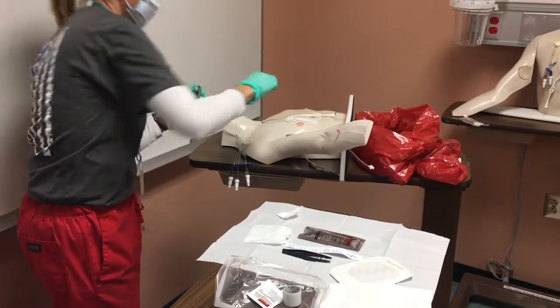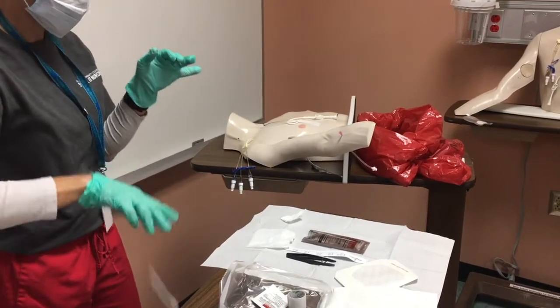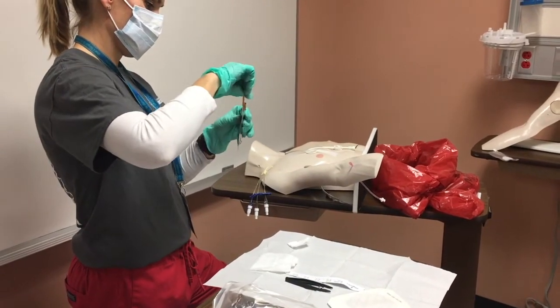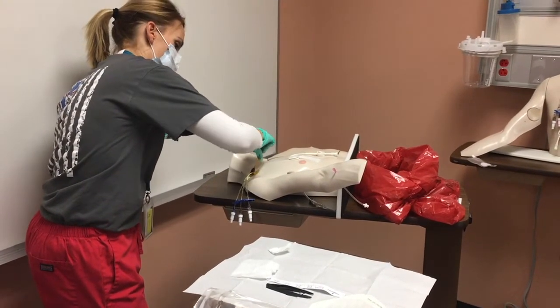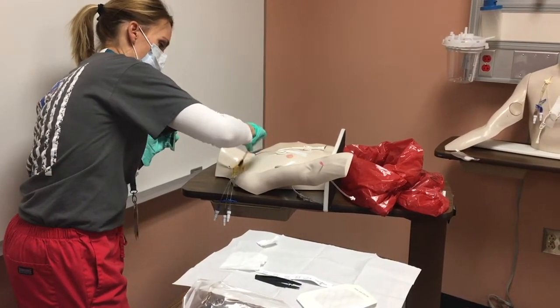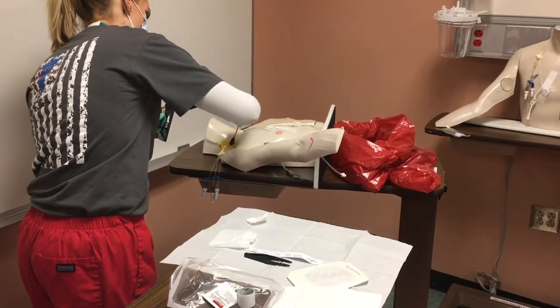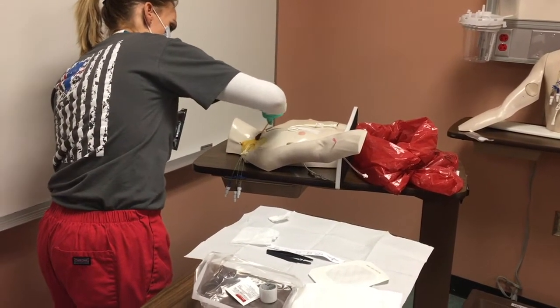You can touch anything within the area that you're cleaning — you just cannot touch outside of that. I'm going to let that dry. Once that's dry I'm going to go ahead and use the betadine. Same thing — scrub and then go around. It's okay if you miss a spot; you can get it with the next time that you go around. Just want to get that whole area. Make sure your patient's head is turned to the side. Then you're going to let that dry.